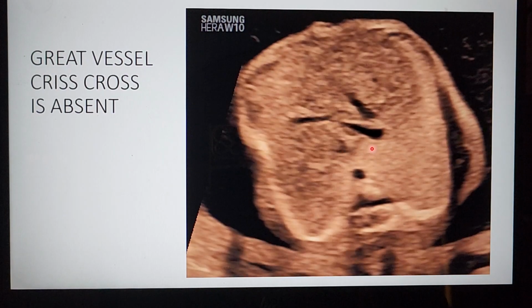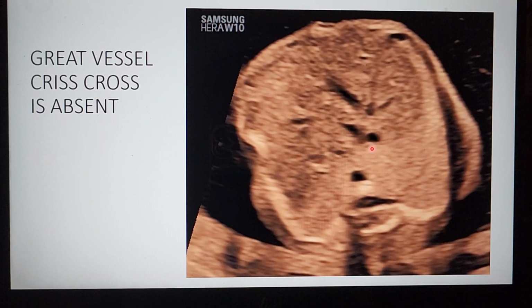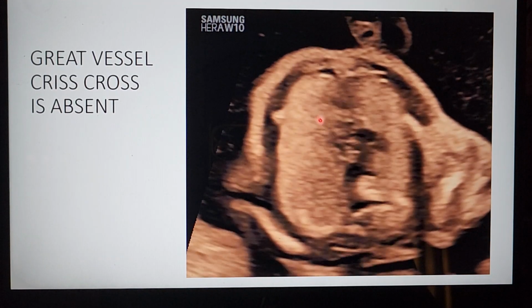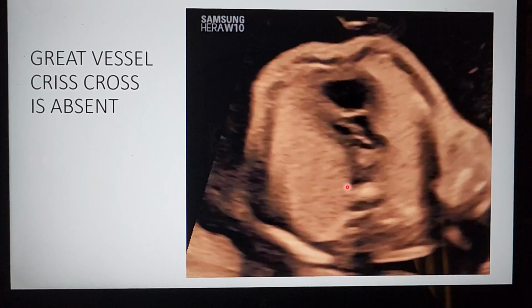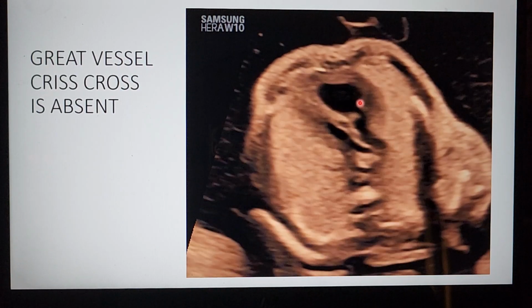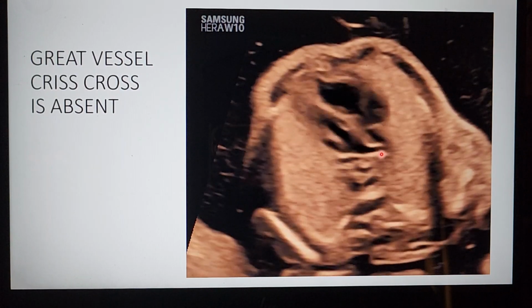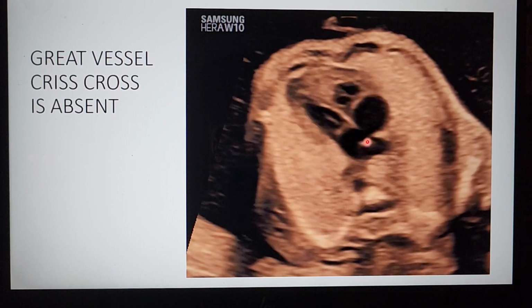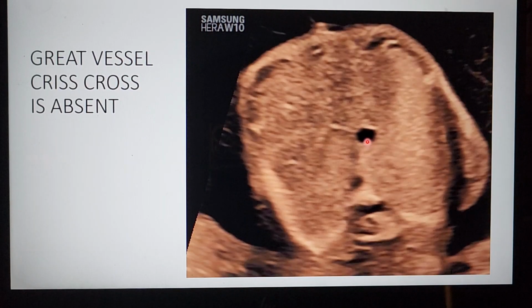Now we will play it again. So from below, now you can see that from the left side comes out a vessel which branches, from the right side comes out a vessel which doesn't branch. There is no great vessel crisscross, and both the vessels are parallel to each other.